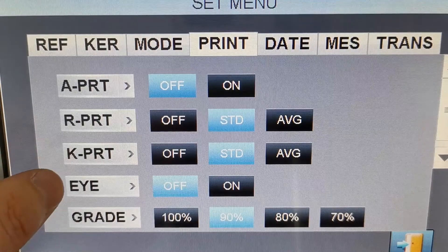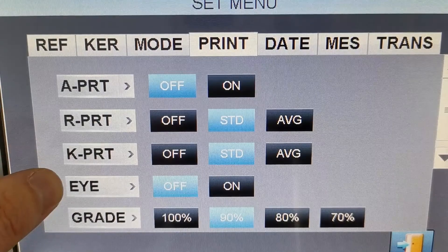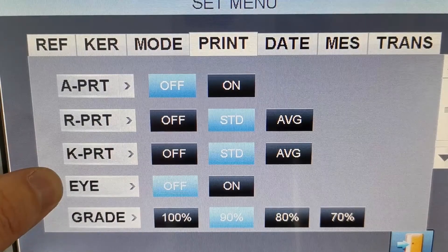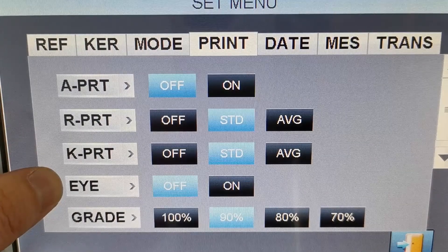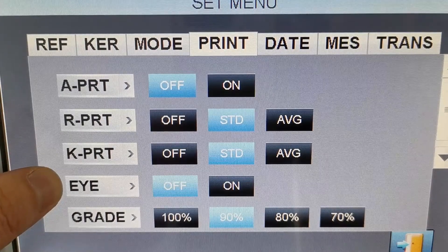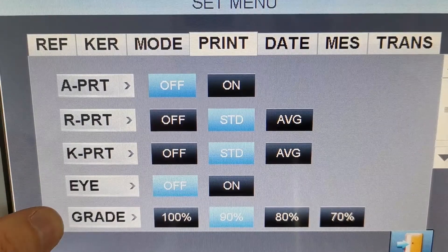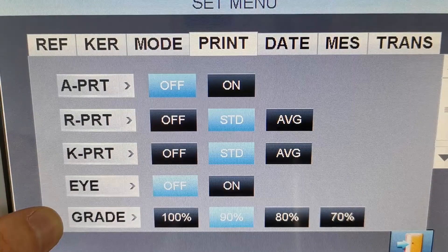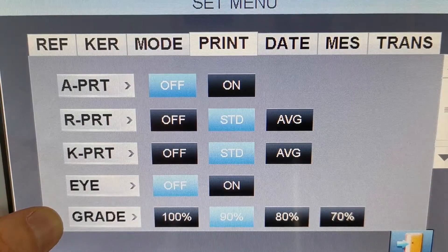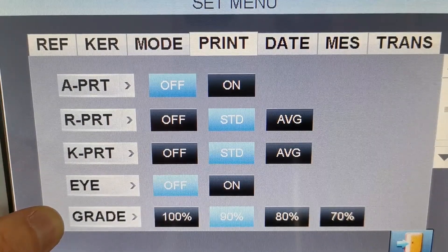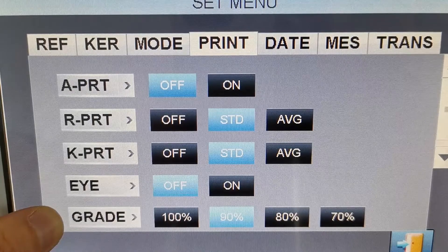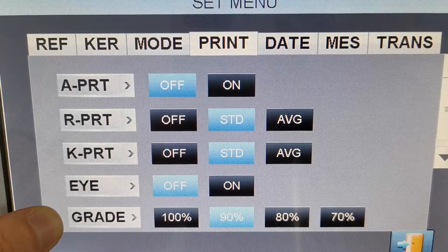This is to select whether to print the eye image or not. And this is to select the printing density.